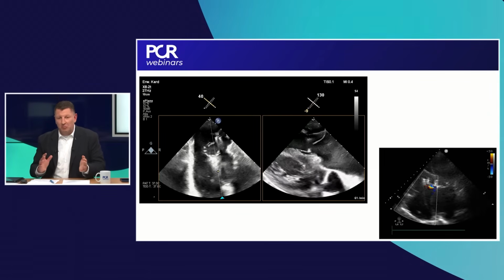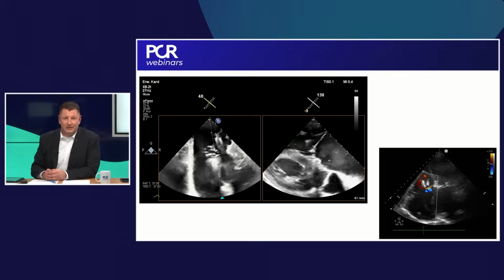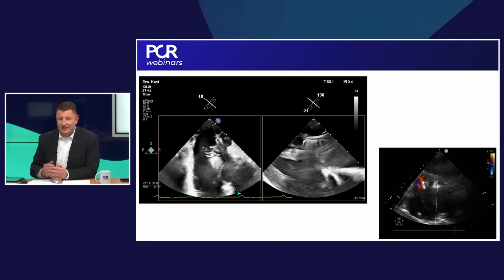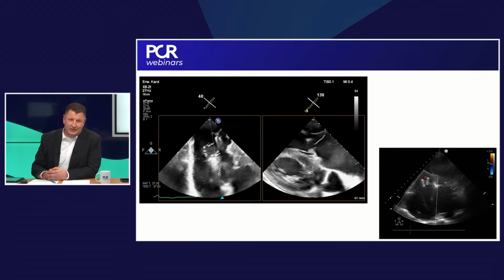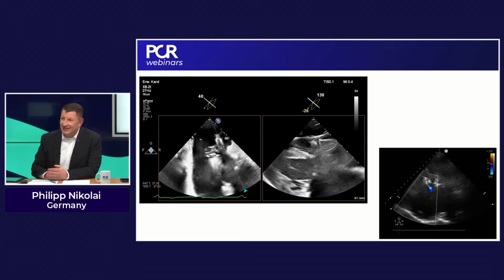Yes, absolutely. So it is very interesting to bring the lead to the more posterior side, and also interesting that we end up with a light to moderate tricuspid regurgitation. And it's also interesting to see, can you please start this slide again, that the tricuspid regurgitation doesn't come from the lead side, it comes directly from the central side, so that we can also say this is a lead-related TR, not a lead-induced TR. But to be honest, we want to be perfect, not just good. This is a good result, yeah.